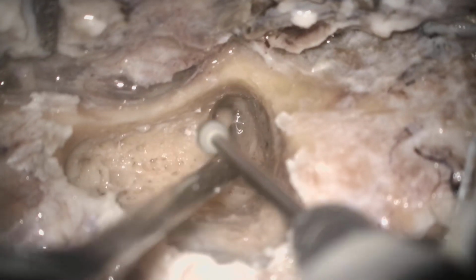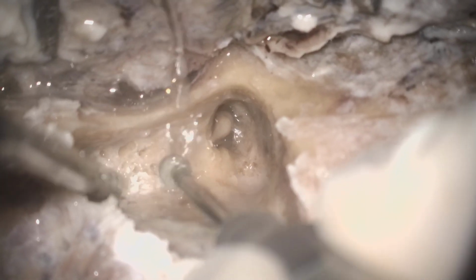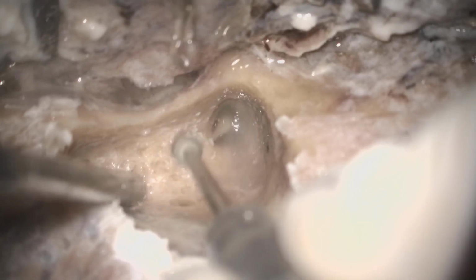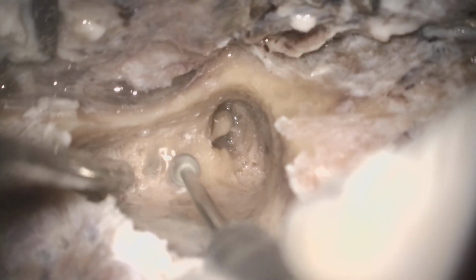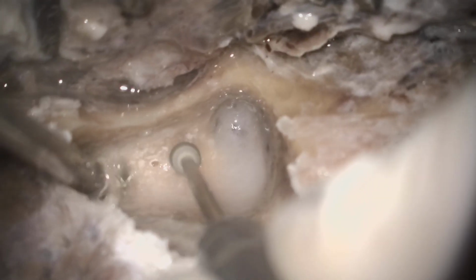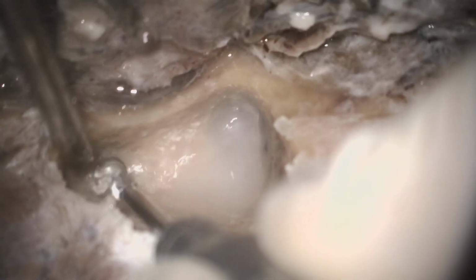So for posterior tympanotomy, what is the landmark? The basic landmarks of posterior tympanotomy, or the basic area, are the chorda tympani, the facial nerve, and superiorly the incus buttress. For the direction of the facial nerve, we have two landmarks here. One is our lateral semicircular canal and second is the incus. So the direction of the short process of the incus actually defines the area of the facial nerve in the vertical segment. For that reason you have to drill all the cells and go up to the facial nerve.